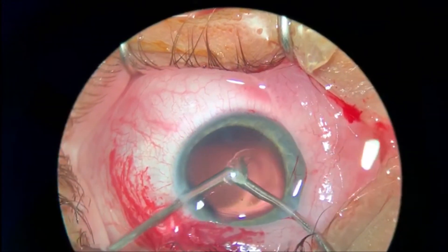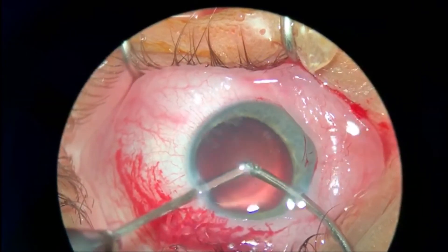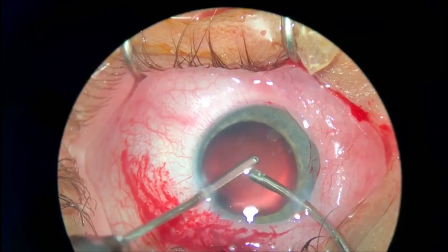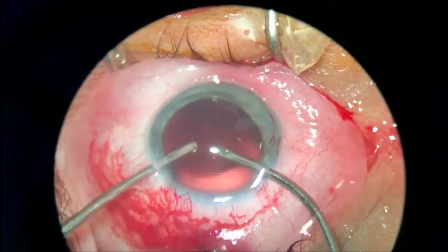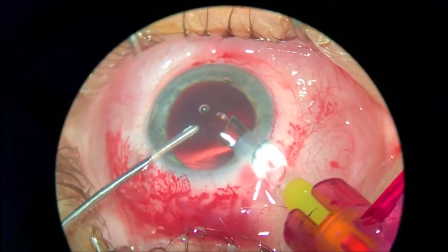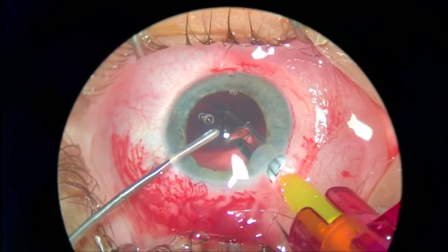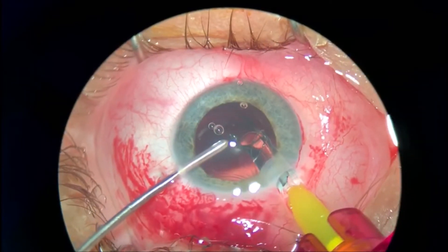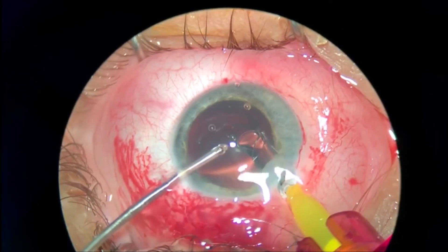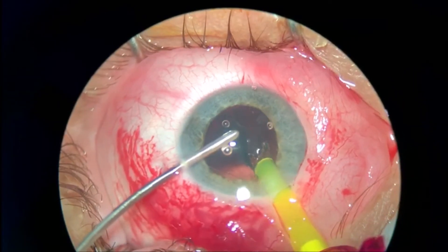At the end you have a clean bag. I enlarged the main incision and in this case injected the multifocal IOL under the irrigation port, so there would be less viscoelastic to remove at the end of the surgery.